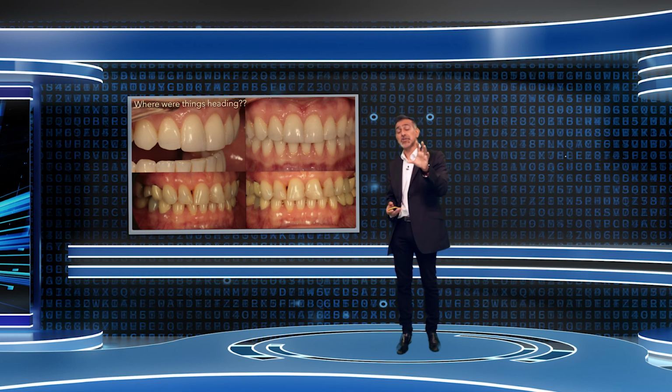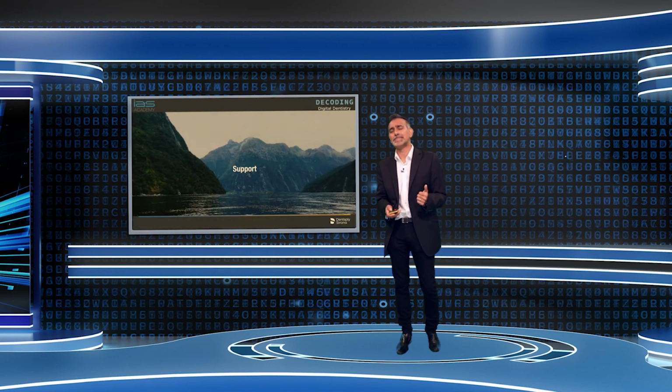I know if this patient carries on with this sort of dentistry, carries on seeing me, she will never end up in the position that her mum is at. That's really, for me, the goal. And you can see what this does to someone's smile. Even that very subtle amount of tooth movement, not many aligners done, it can massively change someone's appearance. But what makes me even happier is not just the aesthetics, it's knowing that this patient's teeth are functioning much better, which is the way they should be.